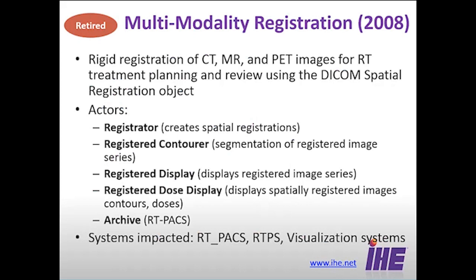And it may sound silly, but a registered displayer is something different than a dose displayer, because one does just the registered images and the other one actually displays the dose. So we tease those differences out, and we have details on what each of these actors needs to do, and this is all tested at a Connect-a-thon.